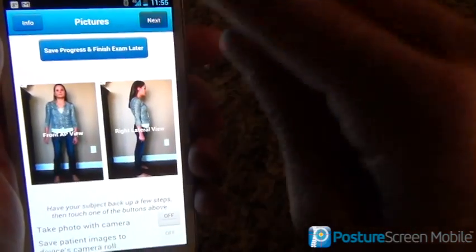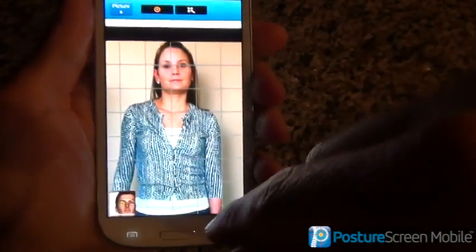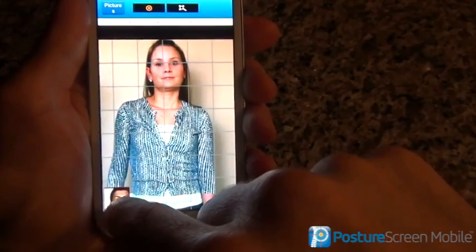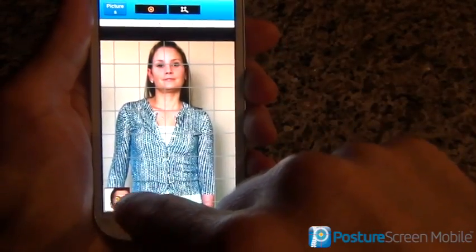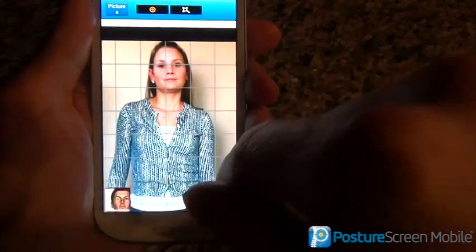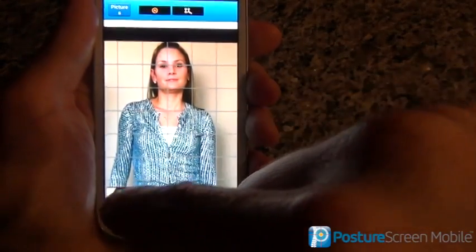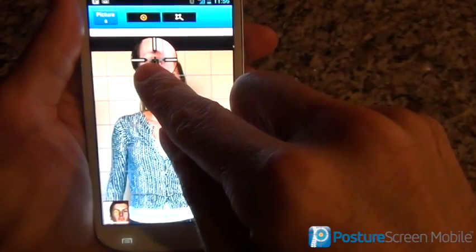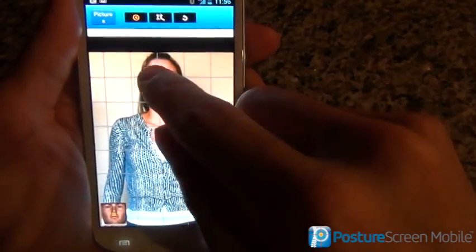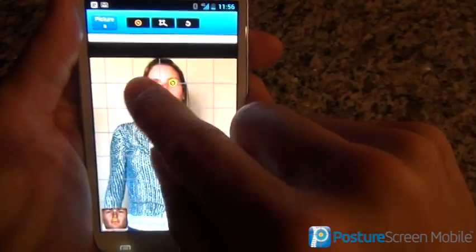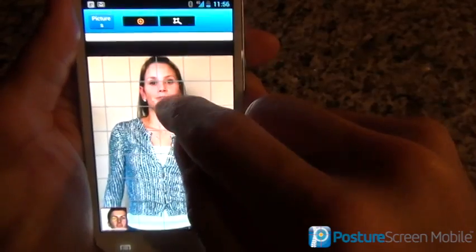Now we're ready to move on. When we hit next, it opens this up. If you're on a tablet, this window may be a little small, but it's always in the same order — you always go left to right, which I should say R left to R right, opposite of the patient. Just click what it tells you. I'm going to come into her eye, then her other eye. If you need to move it again, that's not a problem — just move the dot into place. If your staff made a mistake, you can just delete them.